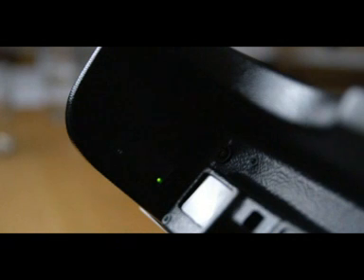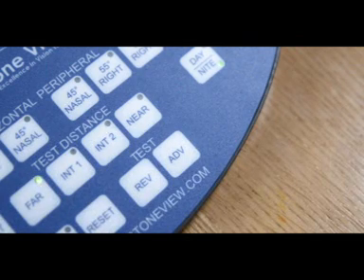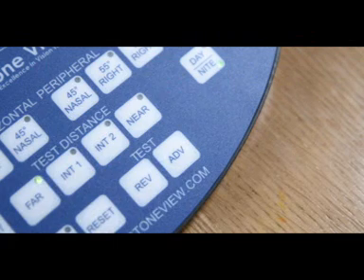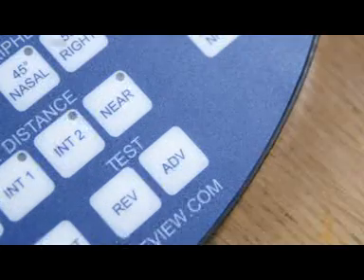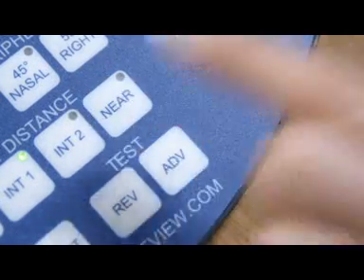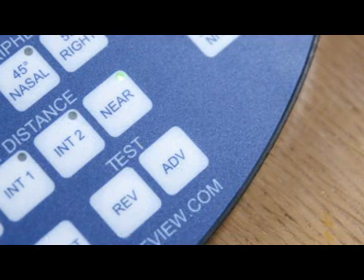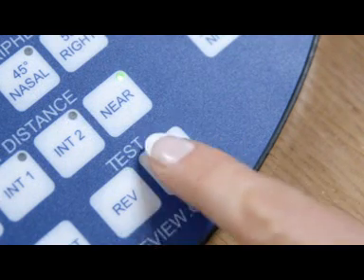When the peripheral vision test is complete, the near vision test should now be conducted. To do this, press the near button on the control panel, then the ADVANCE key each time to go through tests N1 to N6.